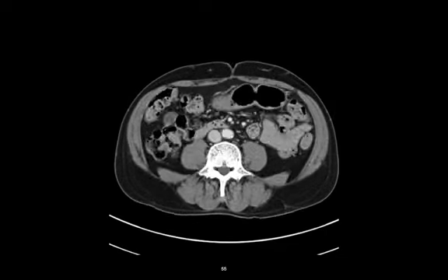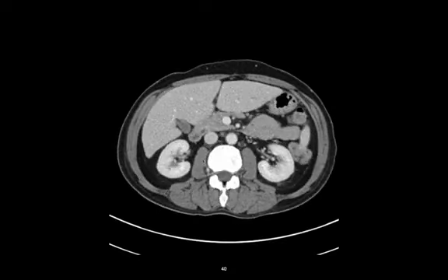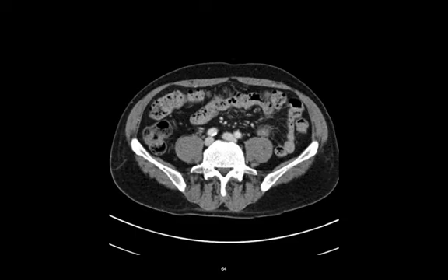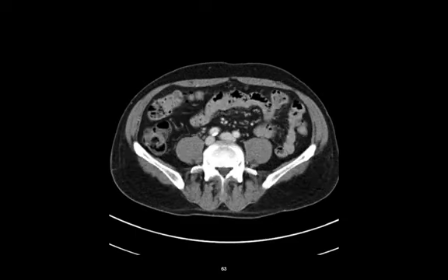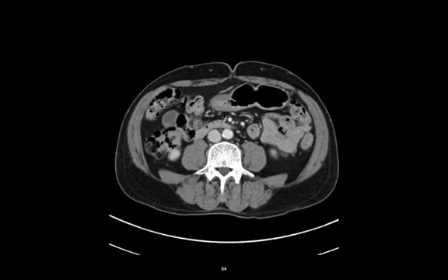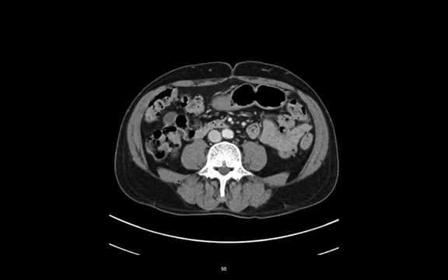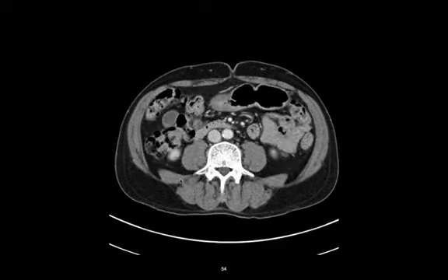That whole thing, the big circle, is the psoas major muscle. Going back up, the psoas major muscle is coming from the vertebral bodies and transverse processes of the lumbar vertebrae. And then we have this quadratus lumborum. The quadratus lumborum is basically coming from the transverse processes. There's our quadratus lumborum muscle right there.